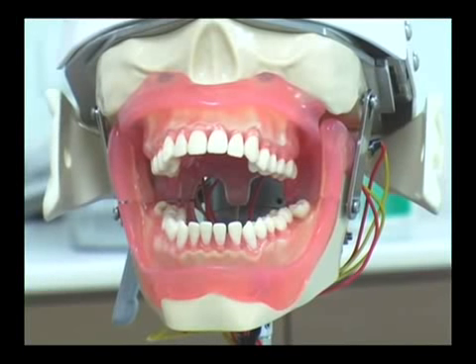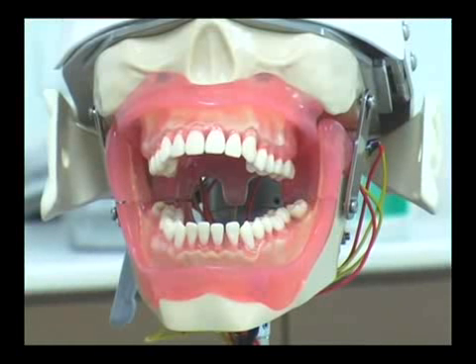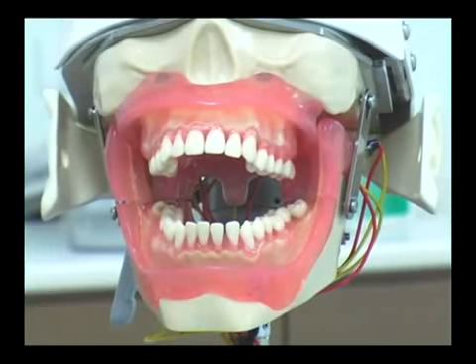Video demonstration for administration of inferior alveolar nerve block on a mannequin. It is very important for the success of the local anesthesia that you should be aware of the anatomy. So we are going to switch to the other model quickly to see what are the important landmarks which we should recognize and identify while administering local anesthesia.